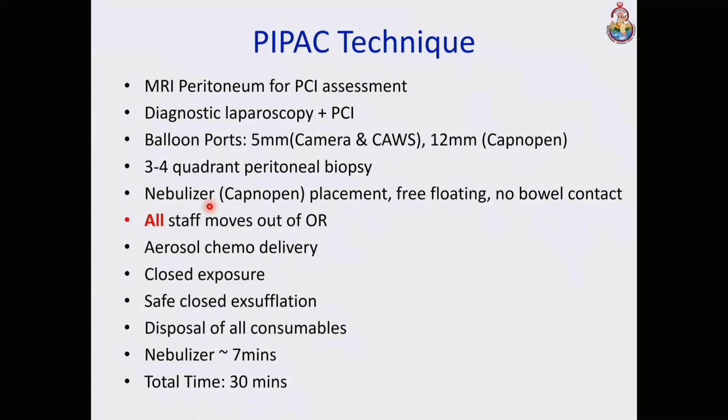And once it is all set, all staff moves out of the OR and aerosol chemo delivery is done either with a remote control injector, or the wire should be such that it can come out of the theater. And as for anesthesia, as Dr. Ray was discussing during his surgery, most of the times it is not inhalation but IV anesthesia that is used, so that everything can be controlled outside the OR.